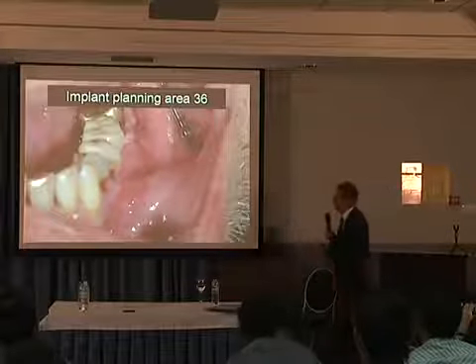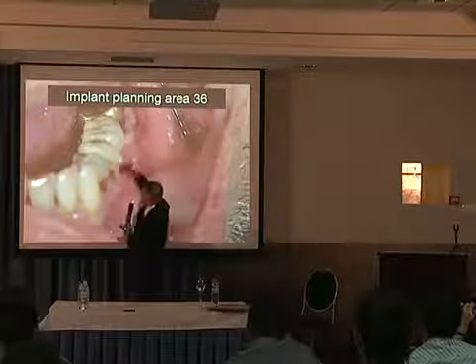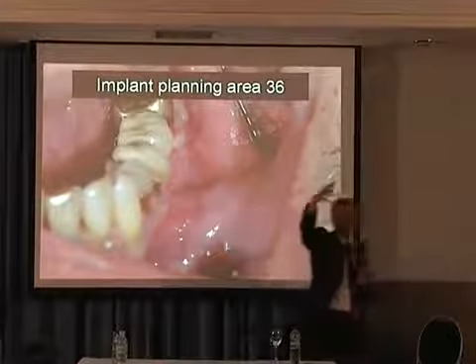And he asked me to give him an implant in that area, a single one. And you see no keratinized attached mucosa, no bone, difficult. The tooth had been missing many years.